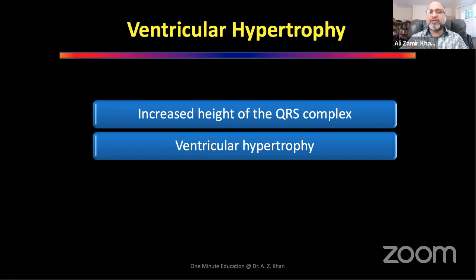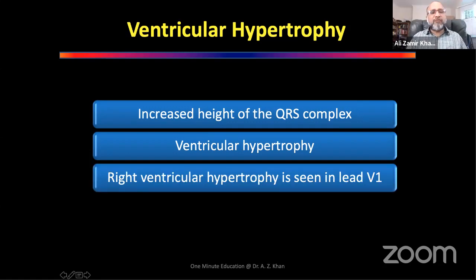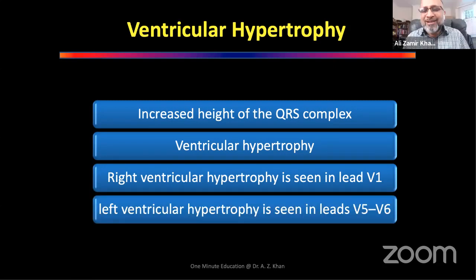Come on, guys, right ventricle, just get the orientation, horizontal axis, right ventricle. V1, V2, very simple. So if there's right ventricular hypertrophy, the tall QRS will be in V1, V2. You agree or no? Simple, it's nothing complex, okay? Where do you look for left ventricular hypertrophy? V5, V6. Is it? So it's not very difficult, as long as you've understood that it's coming towards and against, and you've understood which side the angle the heart is being looked at, it's very easy to identify what is.